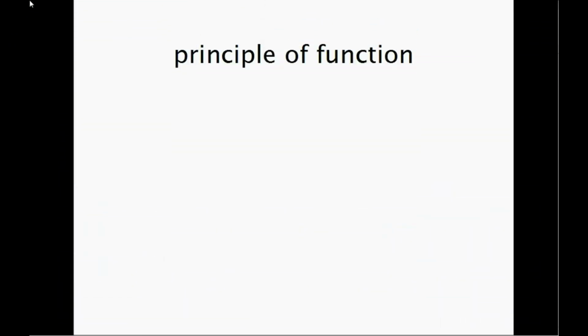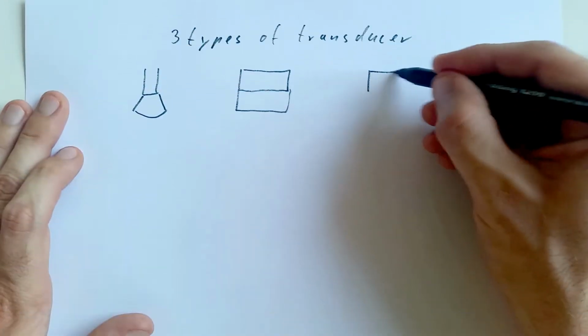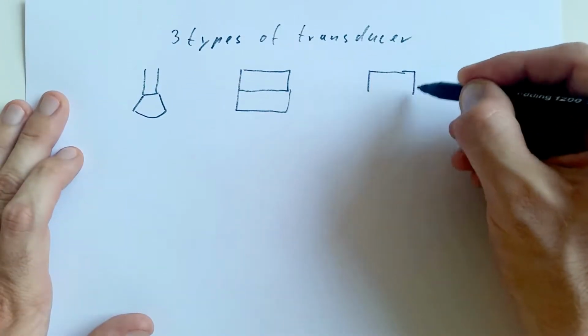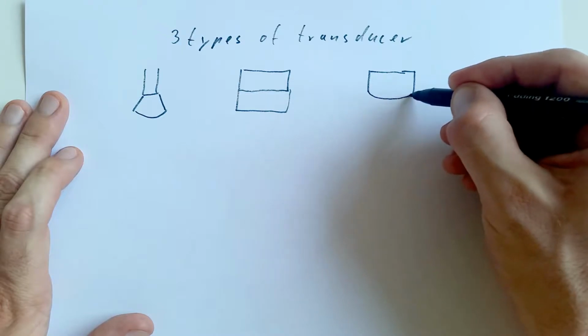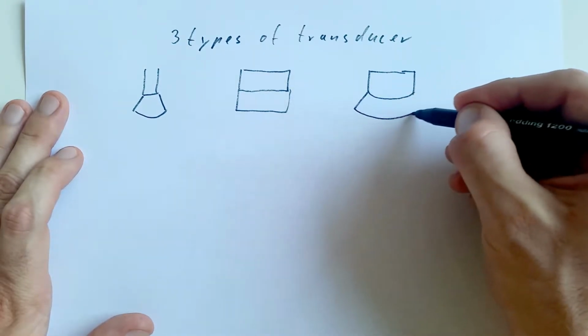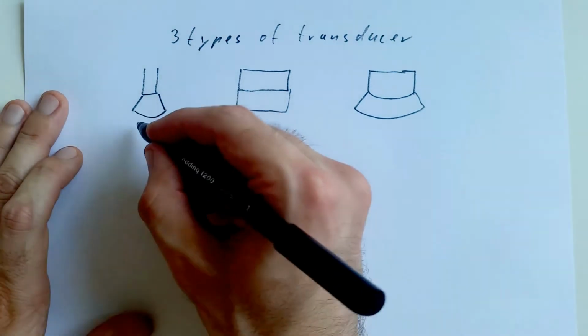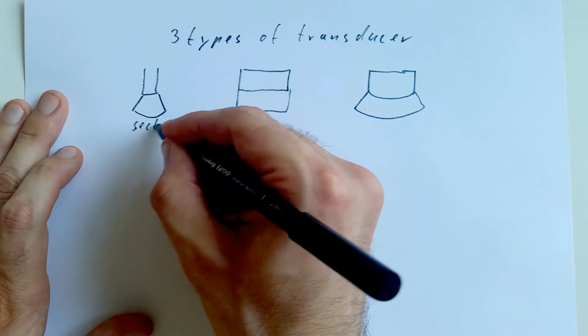So guys, in order to understand everything that is important in relation to the function, we need to focus on two terms in more detail. Firstly, the piezoelectricity effect, and secondly, the Doppler effect. The piezoelectricity effect is a long word, yes. That means for the rest of the video I will use the abbreviation piezo effect, and that takes place using specialized crystals within the transducers.